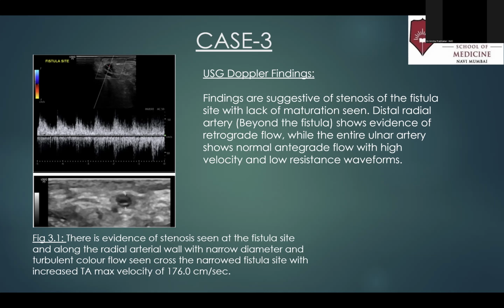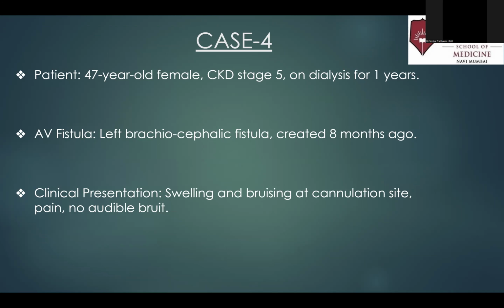Early detection could have allowed intervention before permanent damage could occur. Then the fourth case was a 47-year-old female, CKD stage 5 on dialysis. Patient had a left brachiocephalic fistula created 8 months ago. Clinical presentation was swelling and bruising at the cannulation site, pain and no audible bruit present.